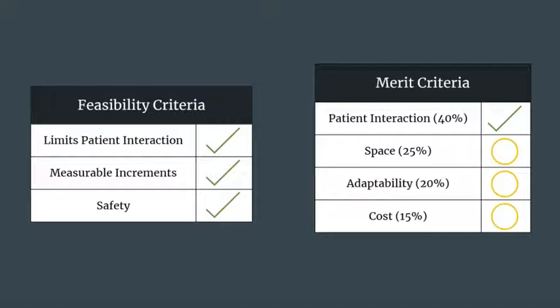Safety, the device is safe. We are using biocompatible materials. We are trying to isolate all the circuitry as much as possible. Obviously in these pictures it is not, just because we wanted to be sure that you can see it in the demonstrations. And then also built into the app are some checks just to make sure that the orthodontist does not accidentally type in a number that is physiologically large.